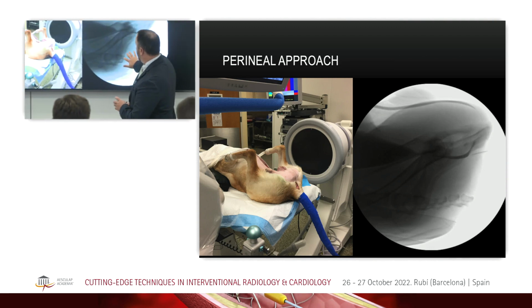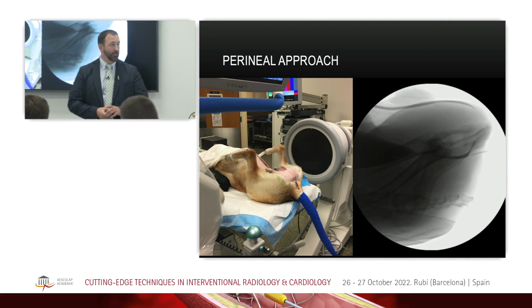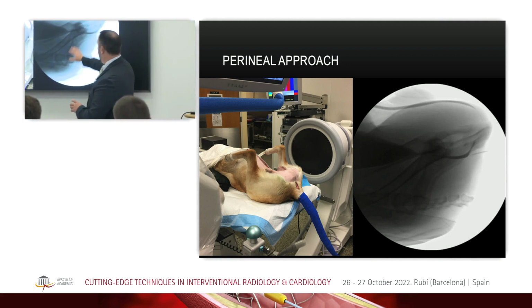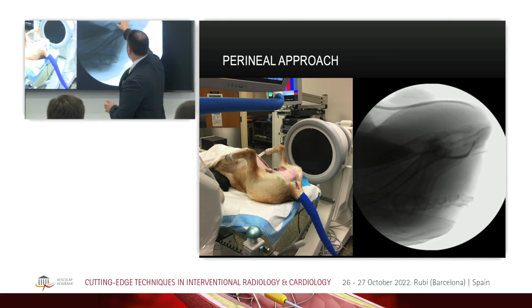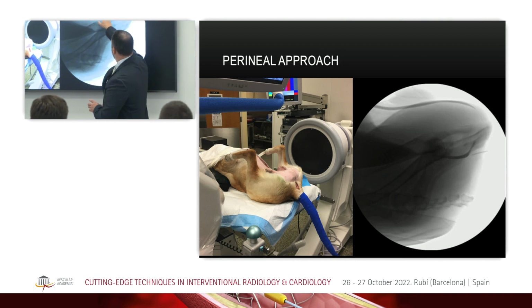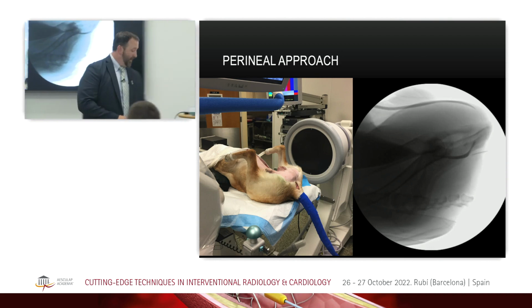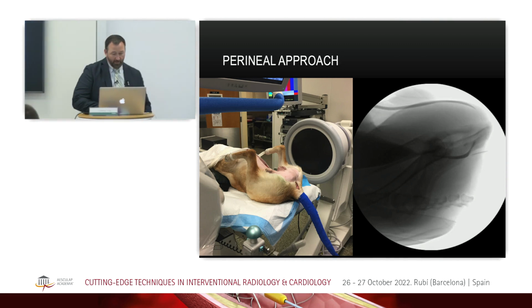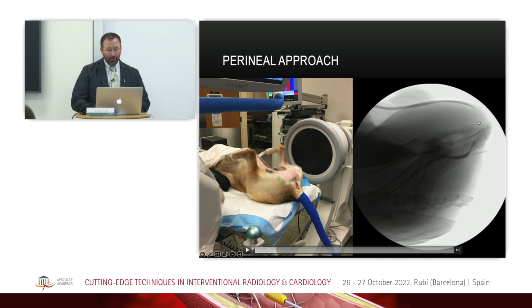What we're looking at on the right is the fluoroscopic image that corresponds to the patient's position on the left. You have the legs forward here, and here's the tail sitting down at the bottom, and we're shooting directly through, and you can see the early contrast cystourethrogram. This is the penile urethra, perineal urethra, and then coming up here into the pelvic urethra. I'll show one here too, just in case you can't see. Penile urethra coming in here, perineal urethra, then pelvic urethra, and the bladder's up here.